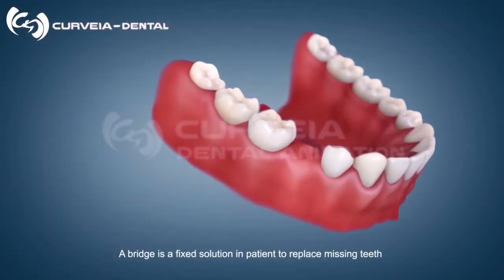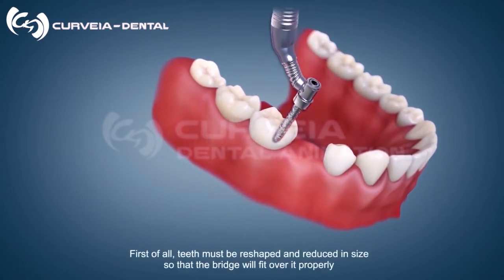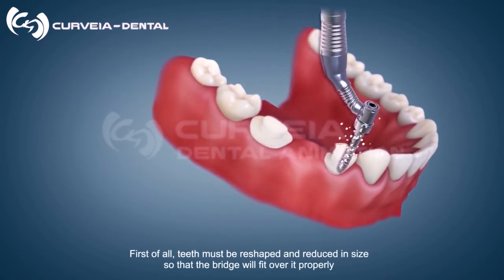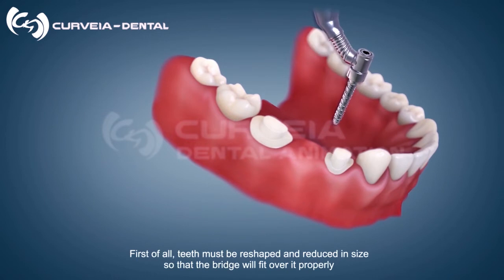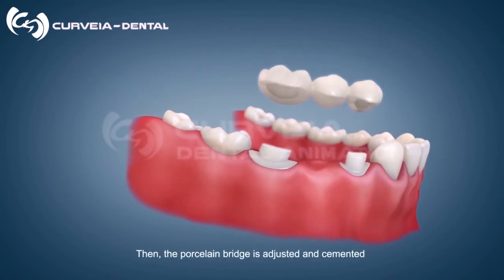A bridge is a fixed solution in patients to replace missing teeth. First of all, teeth must be reshaped and reduced in size so that the bridge will fit over it properly. Then, the porcelain bridge is adjusted and cemented.